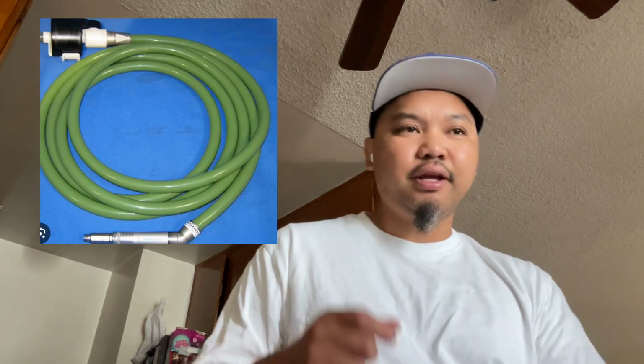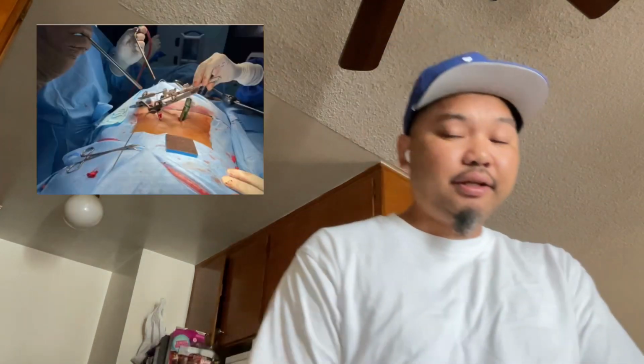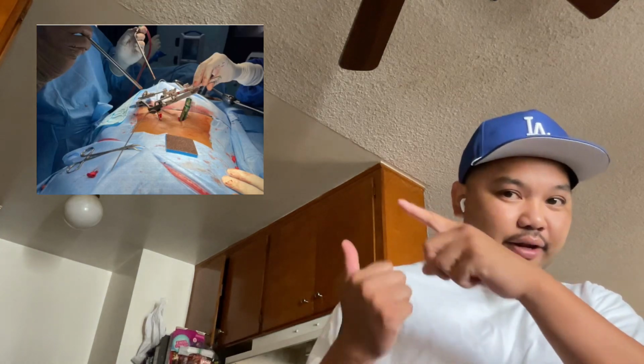Pneumatic powered instruments. Pneumatic, compressed air or gas powered instruments come in various sizes and allow the surgeon to work on small, medium, and large bones. Sternal saws, sagittal saws, and drills are popular pneumatic powered instruments. Pneumatic powered instruments require a hose that can be sterilized. I'll show you a picture of a pneumatic hose right here, and then I'll also show you a spine drill right here. That's pneumatic. It's called a Midas Rex, commonly used in spine. I'll put it right here.